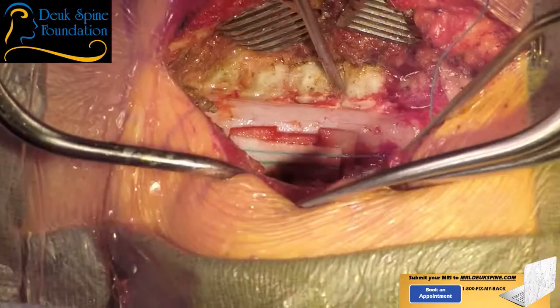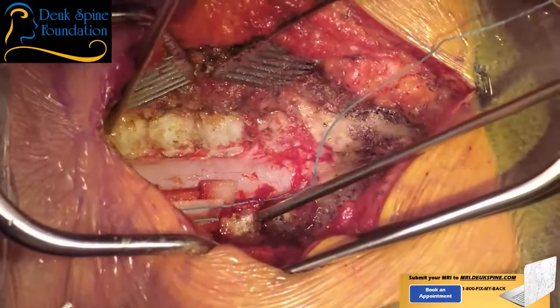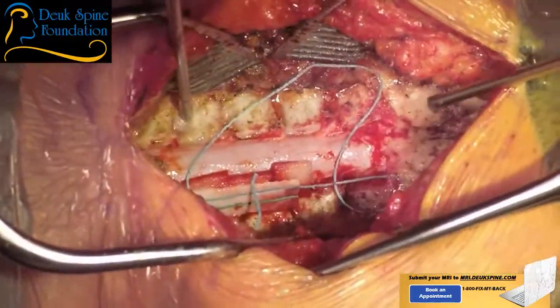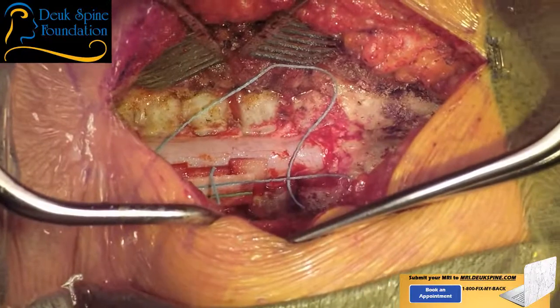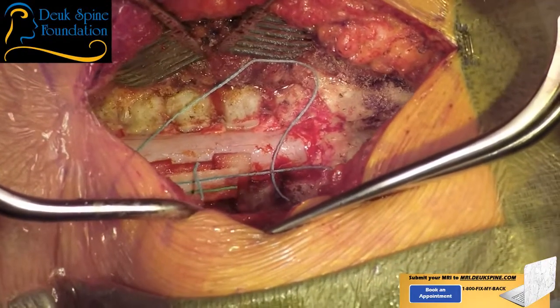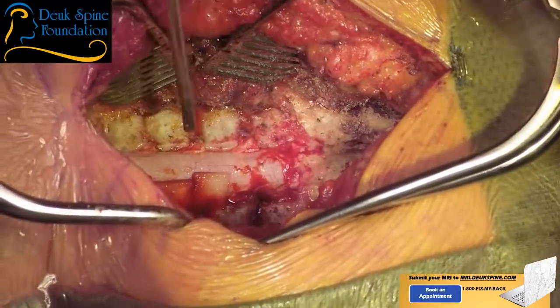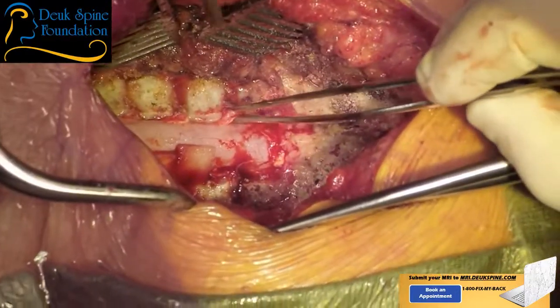Hold on. So the first thing we do is hemostasis. So I want Dr. Atwater to see this once I get started. Pickups. Now you see the foramen, right? Do you see what's coming out of the foramen? I'll show it to you. Right here. You know what that is?